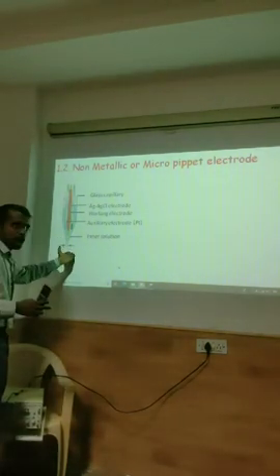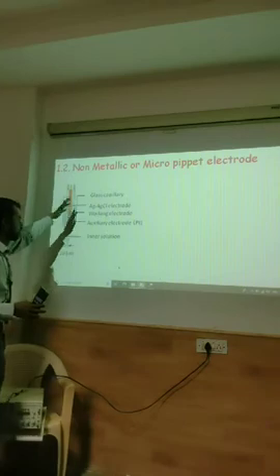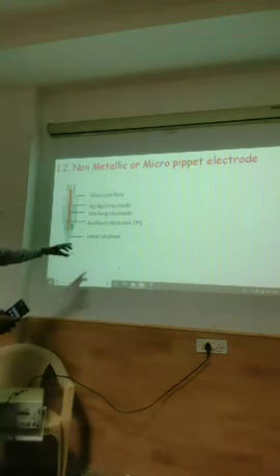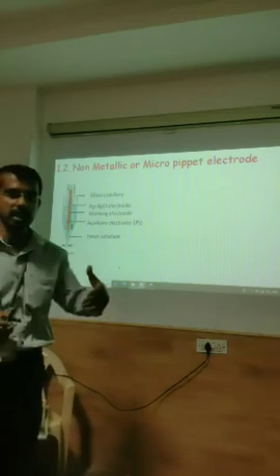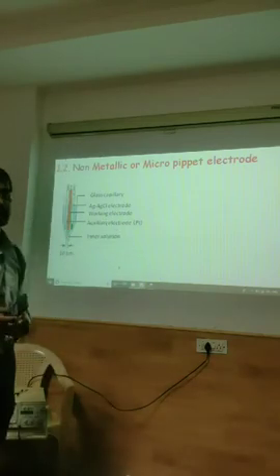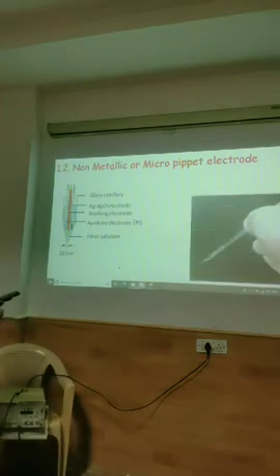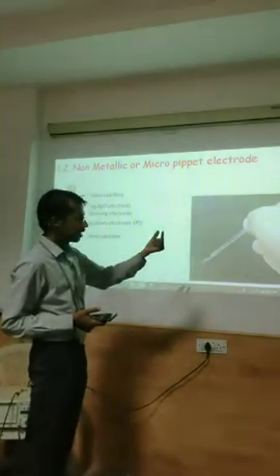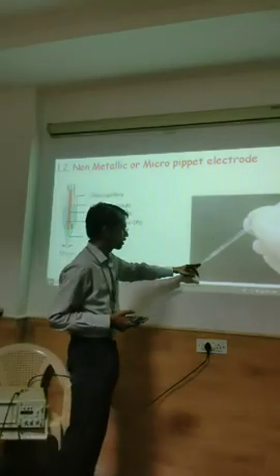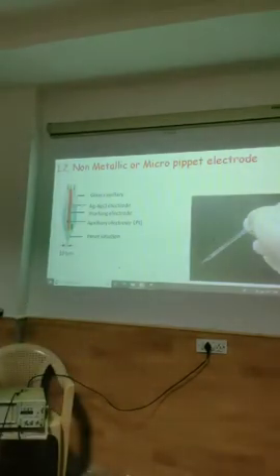From there the ionic signal goes to the wires. To take out the signal, there is a silver silver chloride (Ag/AgCl) electrode. The silver chloride electrode picks up the signal and it is given to the instrumentation amplifier, right? So this is the second type. In reality it looks like this. If my hand is this much, it is very small, very tiny, right? That's how it actually looks.